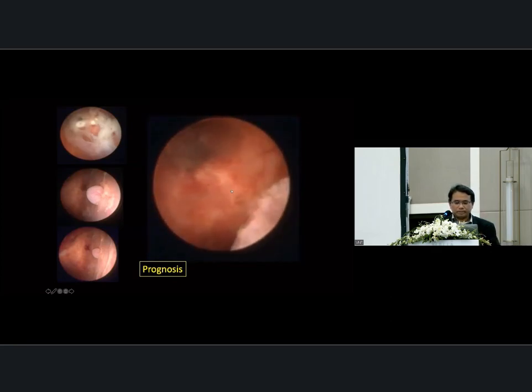So we told the parents it looks like the outcome is not good, despite us doing the revision, but the MRI failed to show that there was metastasis in the ventricle. So this gives you another piece of information visually, and you can take a photo, then you can see the tumor has already metastasized. So you can also give a prognosis.